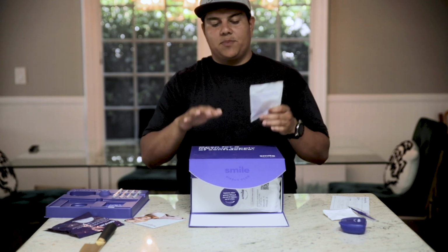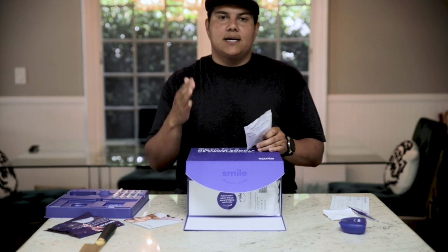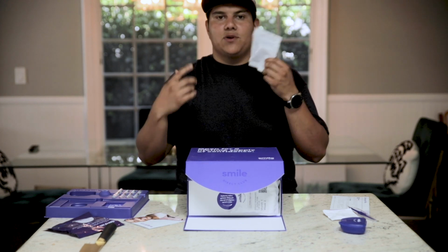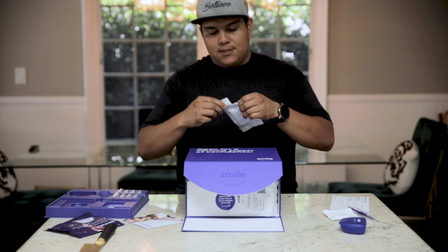So once you get the box, you get an email saying to track the day, because they want to basically remind you when's the next time for you to remove it. Let's take this one off.